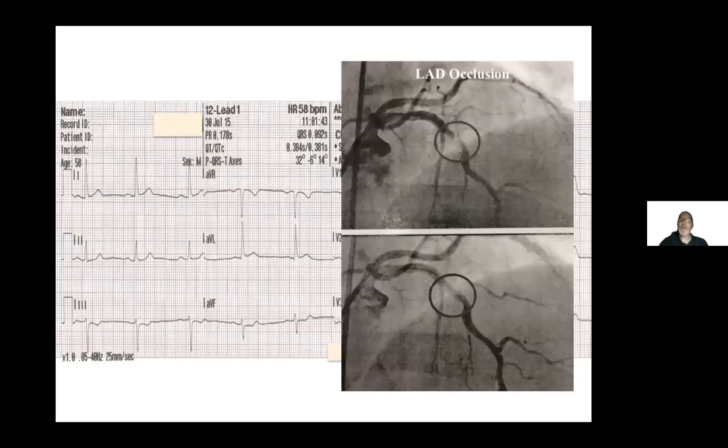So why am I concerned about this patient? Well, first and foremost, any patient having an MI can fibrillate just like that. So I think it's good medical practice, if you are dealing with a patient who's having an MI, to put your R2 pads on them, or your defib pads, or multi-pads.